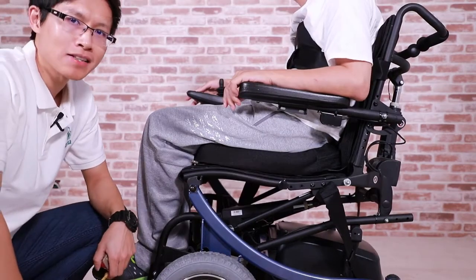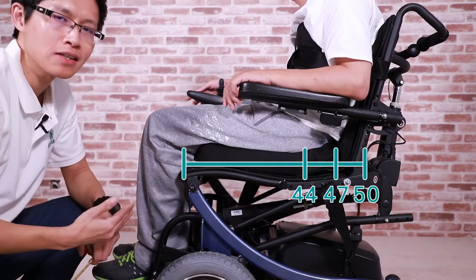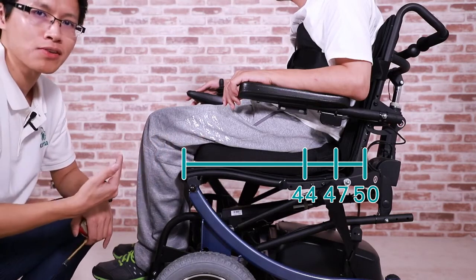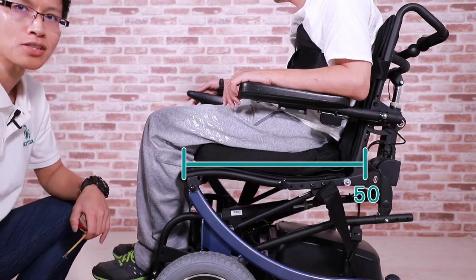The seat depth can be adjusted into 44, 47, and 50 centimeters. Based on what we've measured, Mr. Zhang's thigh is 52 centimeters. Minus the 3 centimeters gives us a number that is close to 50 centimeters.